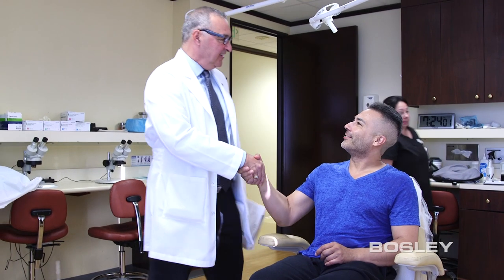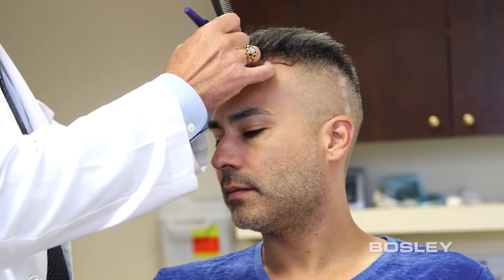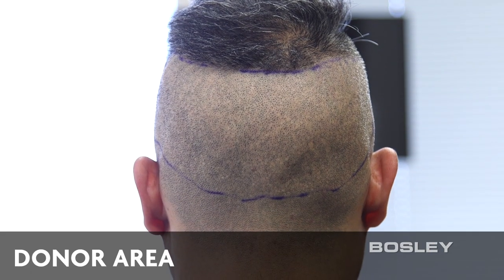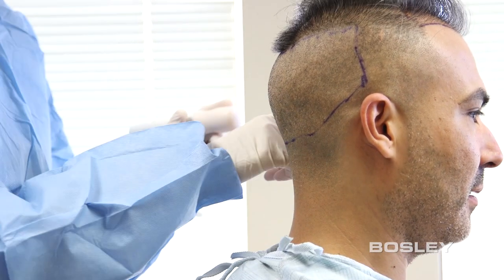In order to achieve the most natural hairline, we first take measurements to use as our guide. We then trim the hair on the rear of your head to create a donor area, where we will harvest good, healthy hair to be used in the transplantation process.